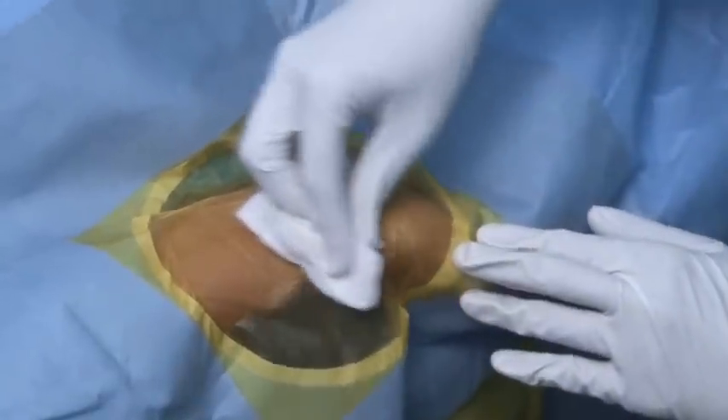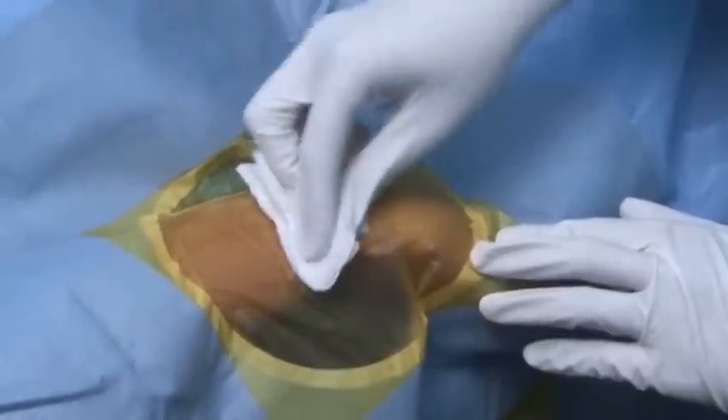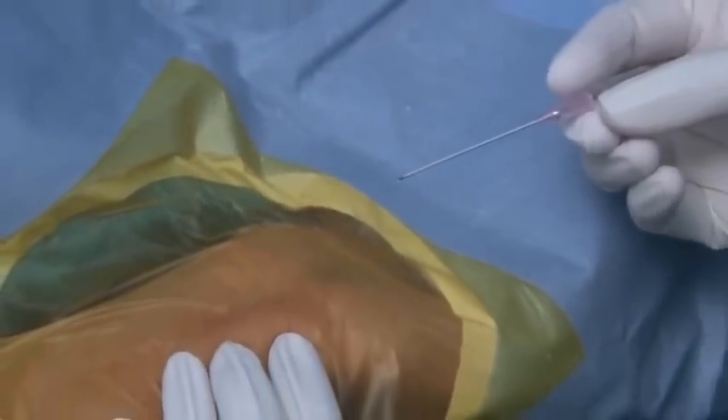We are now trying to disperse the xylokaine so that there is a good local anesthesia effect. The radial pulse is being fixed with two fingers.